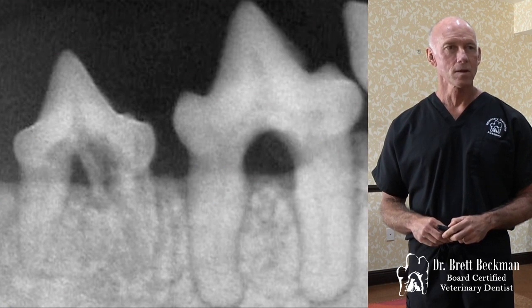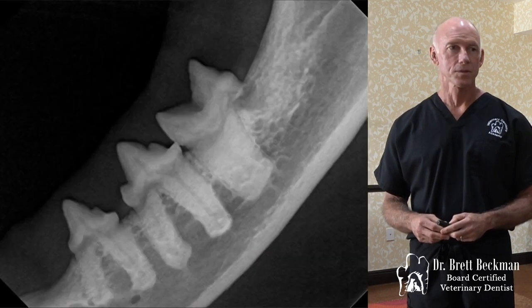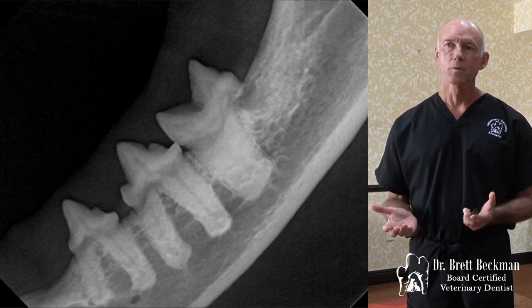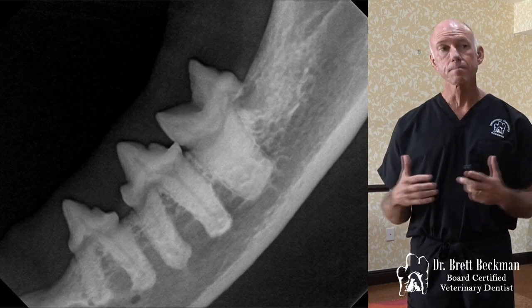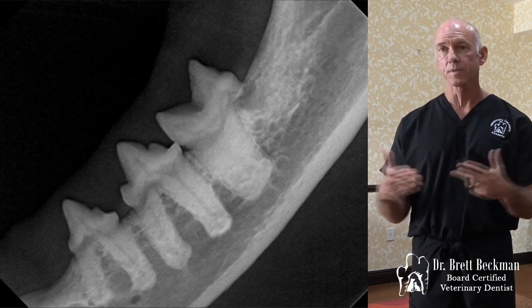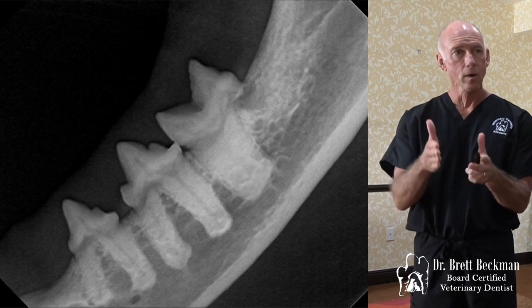I mean, there's no discernible tooth density on the distal root there, but there sure is on all those. So that's an older cat, and that's just ankylosis. That may result in, or that could progress when you have ankylosis anytime. Then you can get progression to external resorption, where the resorption starts on the margins of the tooth root and starts to kind of eat a hole in the side.